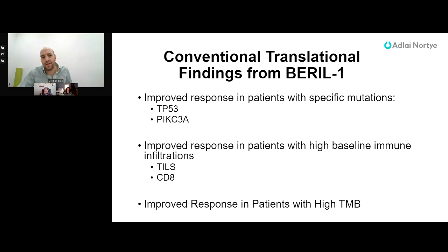We also saw that tumor infiltrating lymphocytes, or TILs, a combination of a CD3 biomarker as well as a CD8 biomarker, which identifies the active or killing immune cells versus the CD4 helper immune cells, were also associated with outcome in the therapeutic setting.